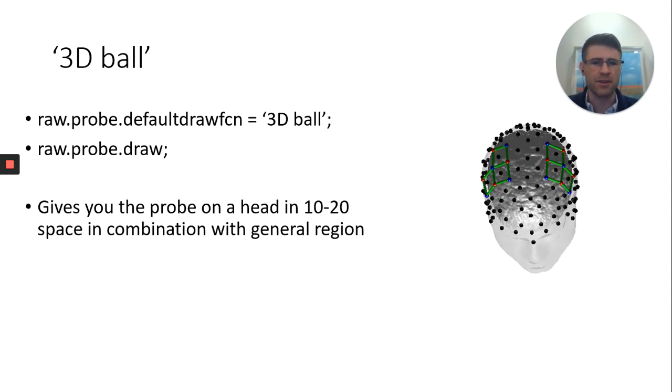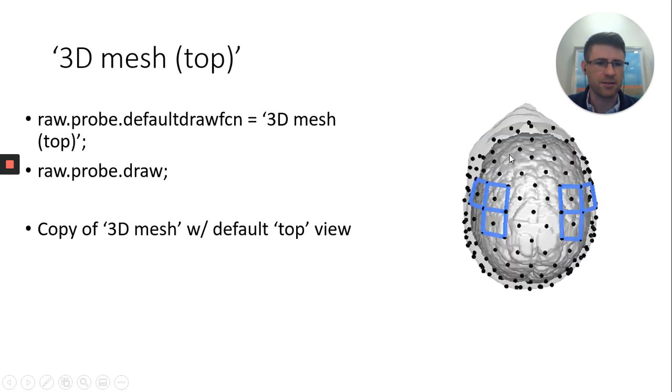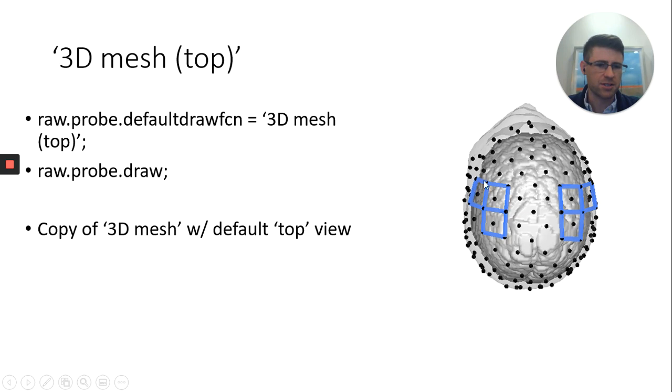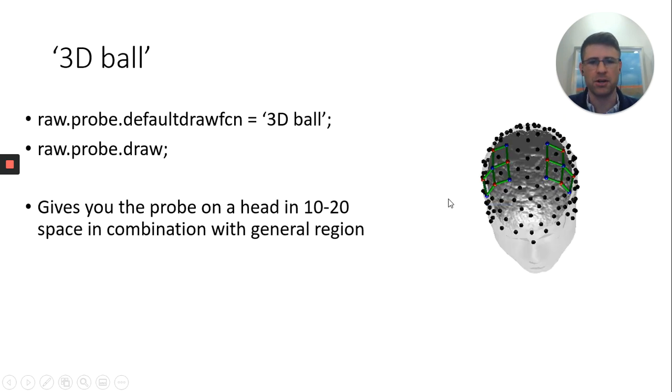And then you have the 3D ball. The 3D ball then, as you'll notice with these, if we back up, you don't know which is source and which is detector. You just see the channels. Whereas if we do 3D ball, you actually start to see red and blue dots. And these can actually be specified as source is red, blue is detector. And now you have a little bit more information there.